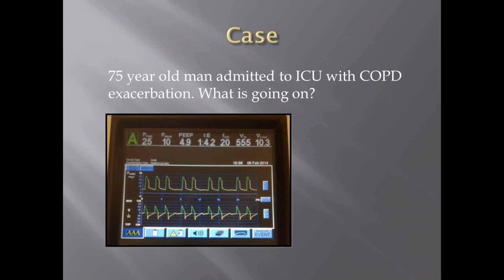What do you think about this? So he has airways disease, and what do you think is going on? Looking at the breath, it's still tachypnic, but these are normal delivered breaths until here. Something happens here, and here, and here. It's tough without actually looking at the patient, but I think he's having like a pause. Yeah, a pause. But actually, if we looked at him, we might see that he's trying to initiate a breath, but can't. So what's this called? Yeah, a missed trigger.